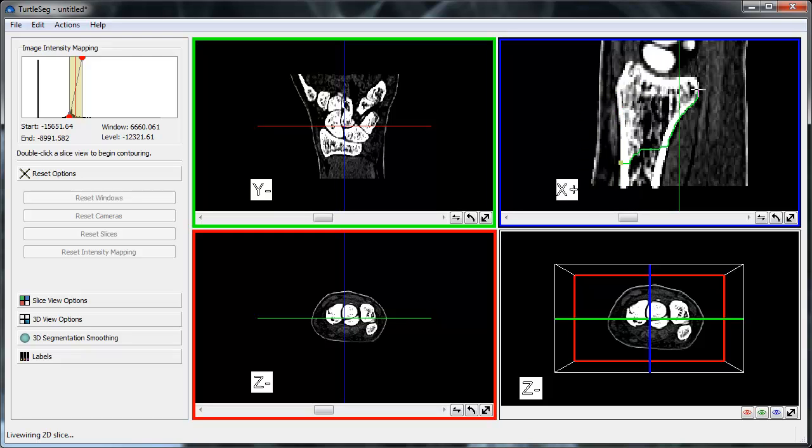When the LiveWire misbehaves, we can left-click to add a seed point, effectively anchoring the LiveWire at that point. The contouring process completes when we click on our initial seed point again.